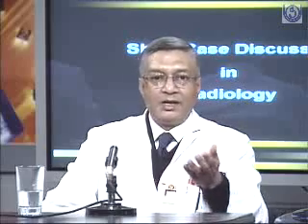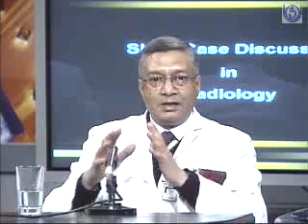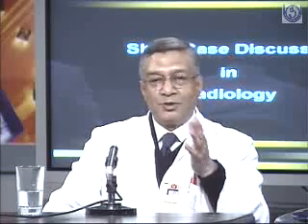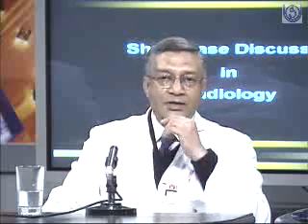So if your scout film had good radiological factors, you got a good contrast on your film. Now you give the dye and you'll get excellent results. But if your first one was underexposed or overexposed, you're going to mess up the whole investigation. So it's always nice to have a scout film to go back and refer to. Yes, that's another advantage of that.